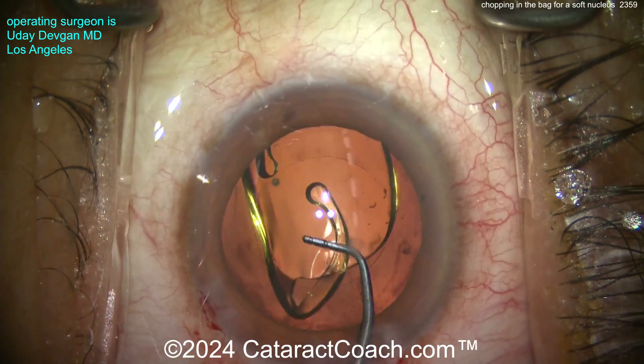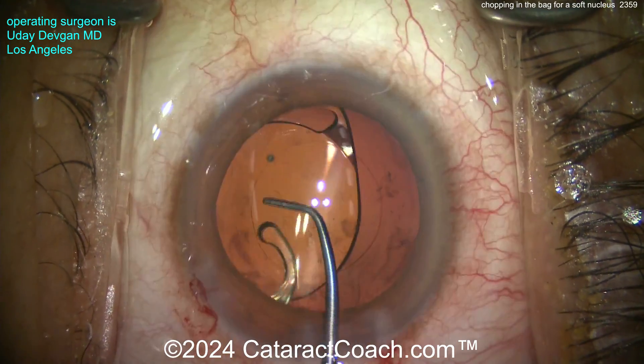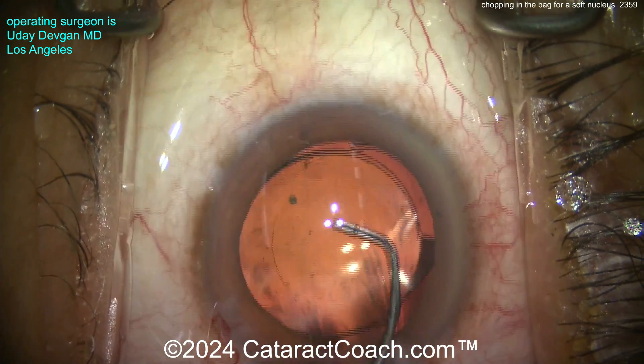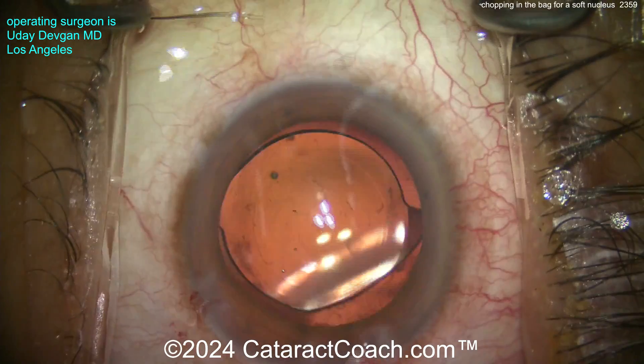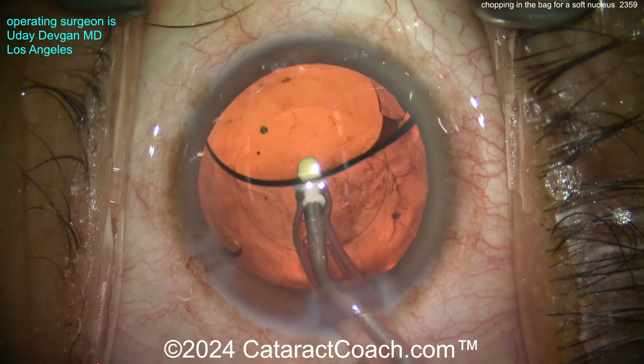Delivering it nice and easy — notice how I keep the eye in primary. Deliver the lens nicely right into the capsule bag, beautifully done. Get that haptic to open up. Now we can judge the size of the capsulorrhexis because we have a six-millimeter optic in the bag. Rotated around — yep, it's definitely overlapping 360 degrees, so it's about a five-millimeter rhexis.